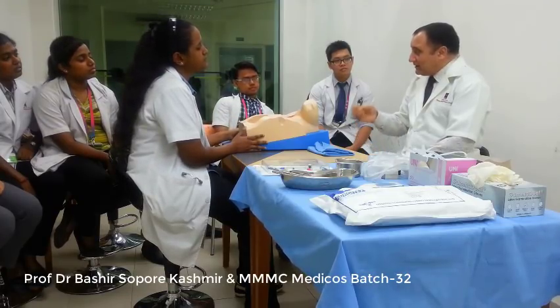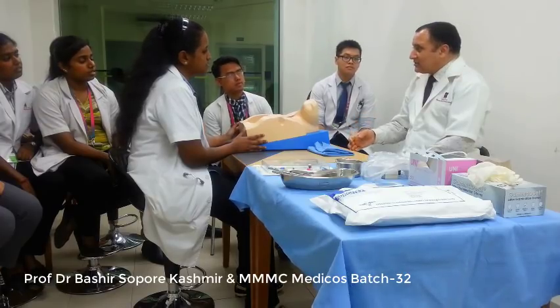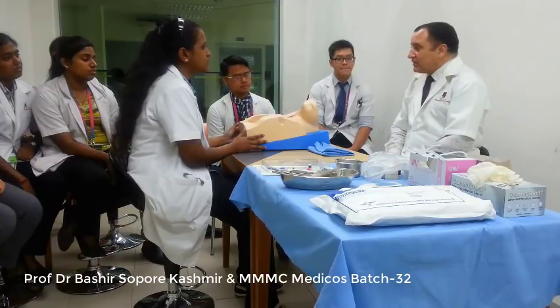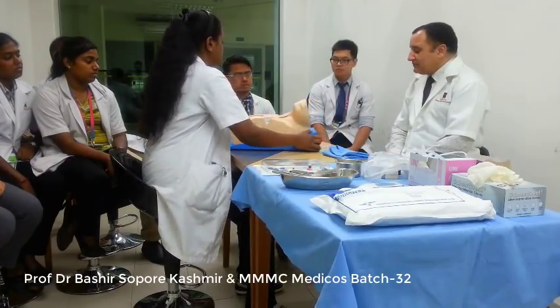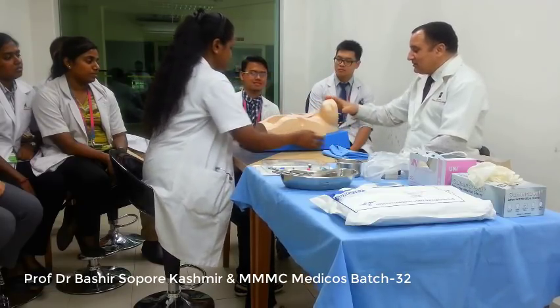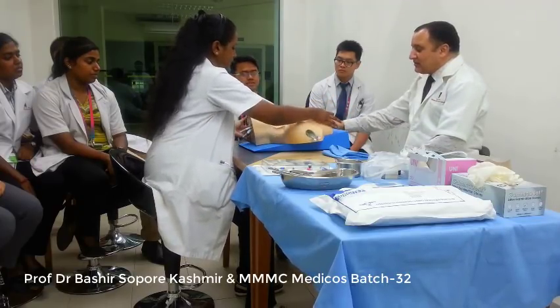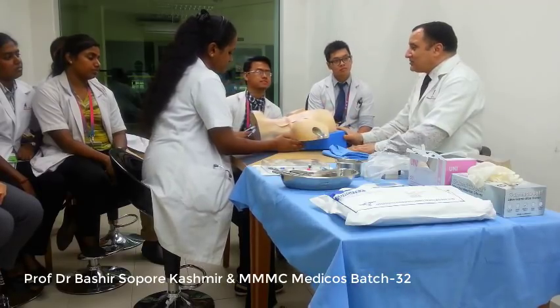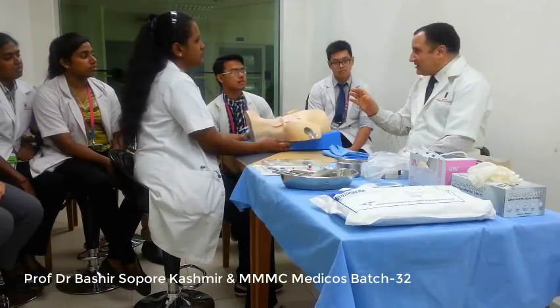The head is not tilted downwards, so you have to change the position of this mannequin, and keep this patient in Trendelenburg position, as I said, between 15 degrees and 30 degrees. Now this is the proper position.